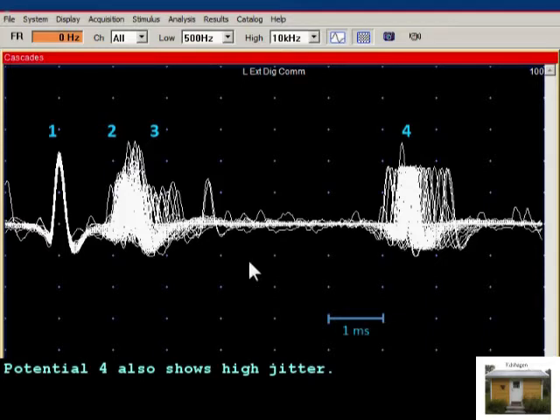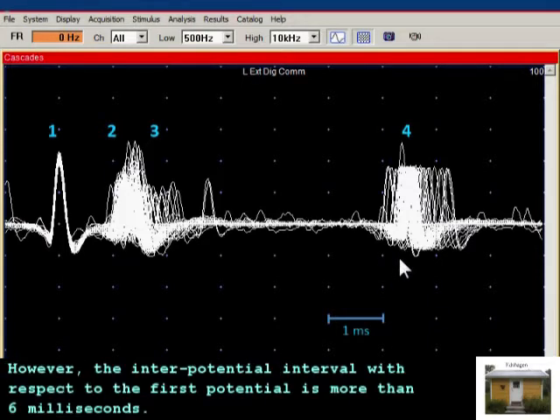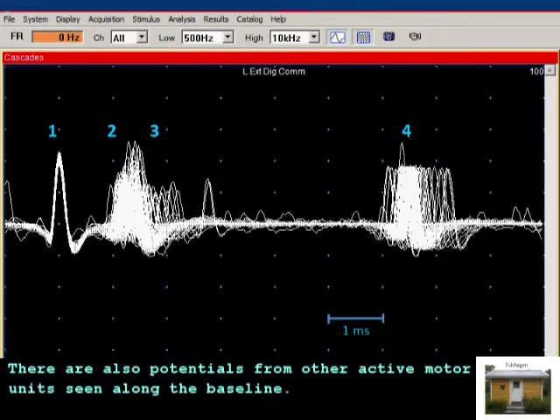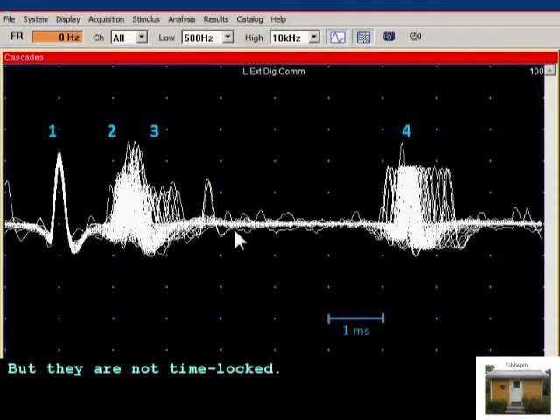Potential 4 also shows high jitter. However, the inter-potential interval with respect to the first potential is more than 6 milliseconds. We cannot see blocking in this display. There are also potentials from other active motor units seen along the baseline, but they are not time-locked.